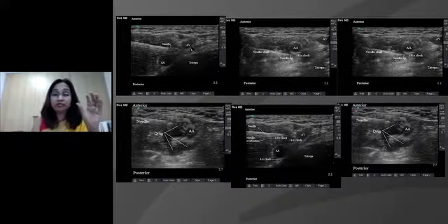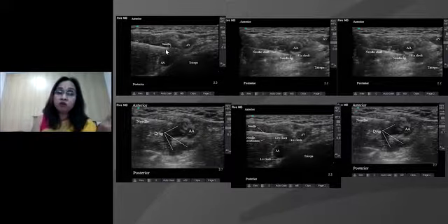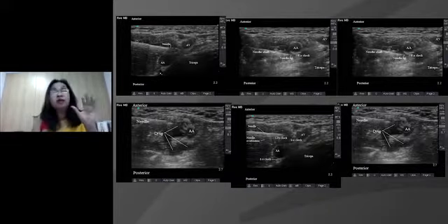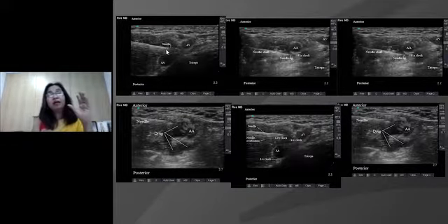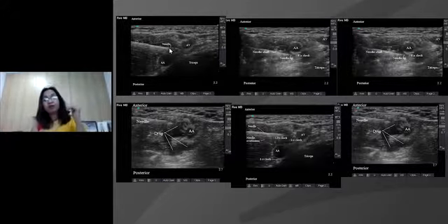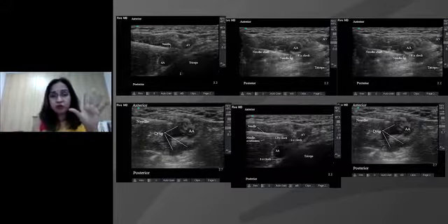Sorry, I showed you the axillary vein. I'm extremely sorry for that. Let's come here. This is the axillary artery. 12 o'clock to the artery, supposedly, is the median nerve. Posterior to the artery would be the radial nerve, and maybe in between the artery and the vein would be the ulnar nerve. So R, U, and M. It can go by that mnemonic. Hence, the anatomy needs to be very clear.